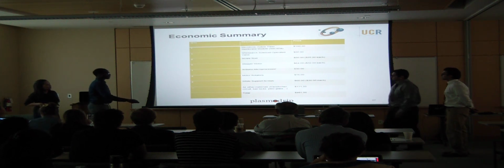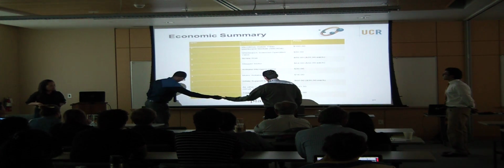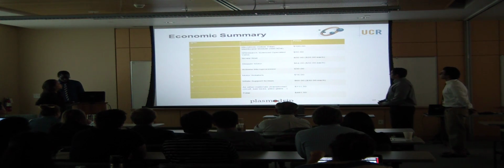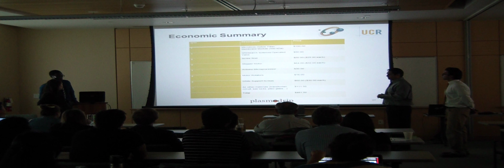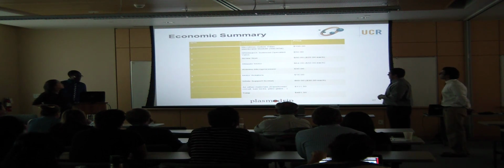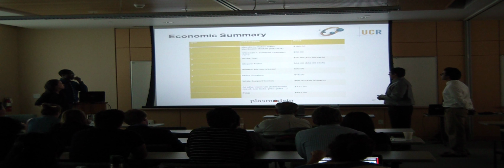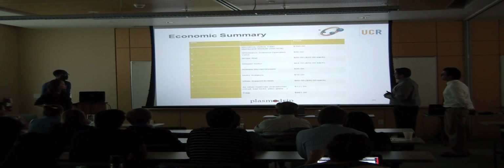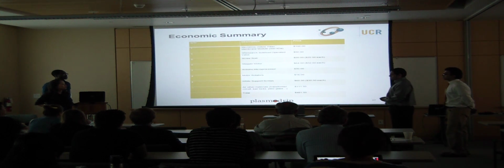And this is an economic summary of our device. As you can see, we significantly decreased the price. The major big ticket items are the hollow fiber membrane, which costs around $100, the stepper motors, which are about $64, and then the brains, the Arduino microcontroller, that's actually pretty cheap, only about $30. The total cost came out to be about $500, significantly less.